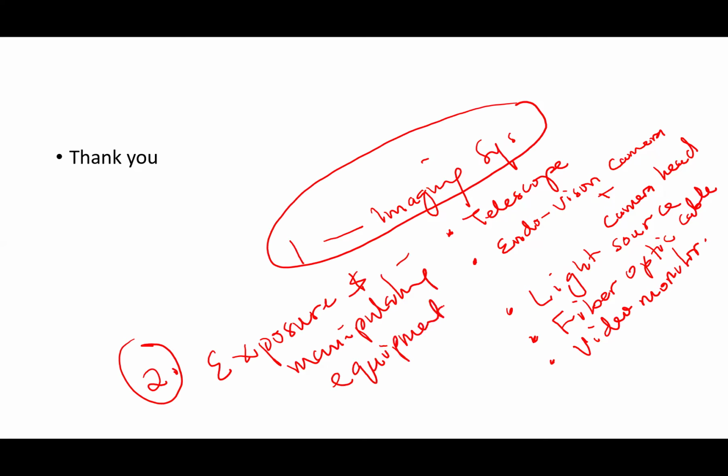To get exposure, you need insufflation with carbon dioxide to create room. So you have the insufflator, which we will discuss in the next lecture. The insufflator primarily uses carbon dioxide to insufflate the peritoneal cavity to create room for vision.